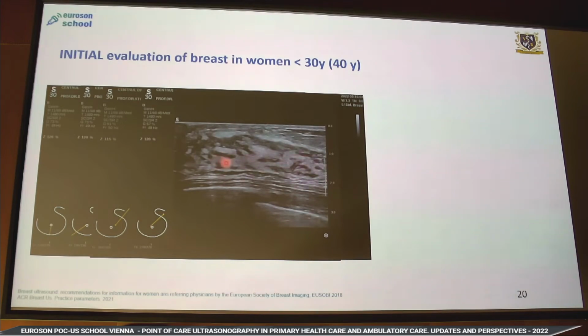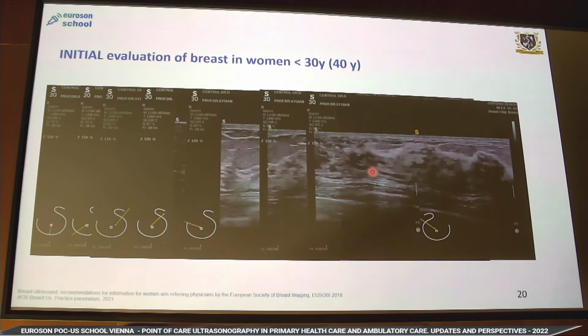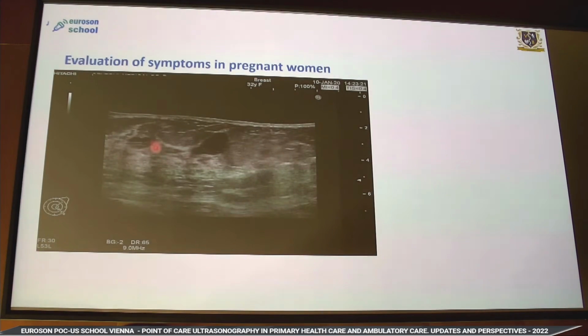This is a little bit of intraductal hyperplasia, which we expect especially in the luteal phase of the female. What else? Side by side, here is a hyperplasia, here is the other one, so you should look further into this. And a very dense breast with a disease of the entire breast, which is a hyperplasia, the entire lobar hyperplasia. What else? Pregnant women, well, at the beginning of pregnancy, the layers that you usually see are there.